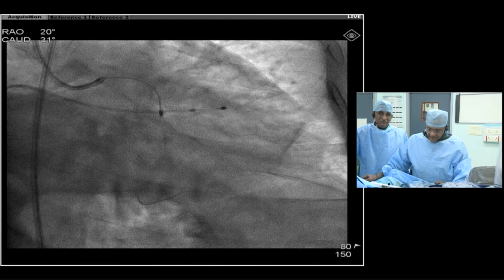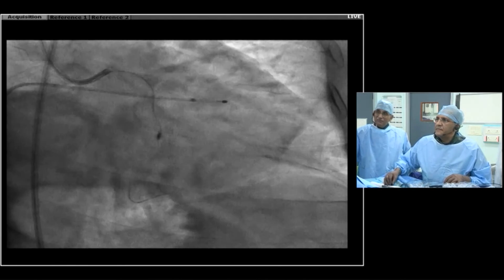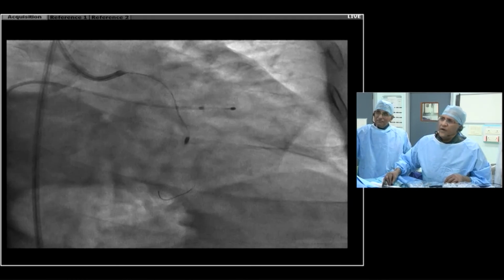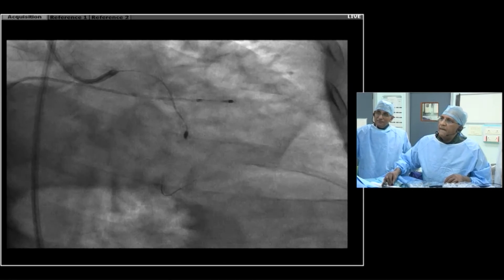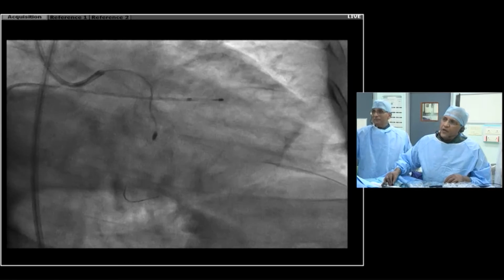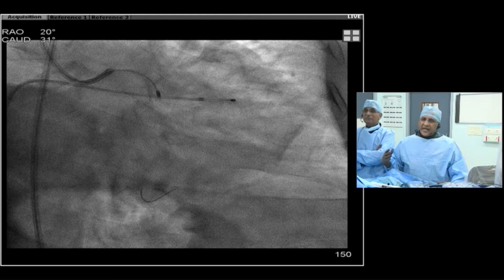I would recommend you use 1.25 if you have problems with 1.5. I don't have a problem. It just is going to take a little longer. And you do 300 seconds before you replace the burr, is that right? Yeah, because we took photographs of the tip of the burr, and we realized that for all the burrs used less than 300 seconds, nothing happens.